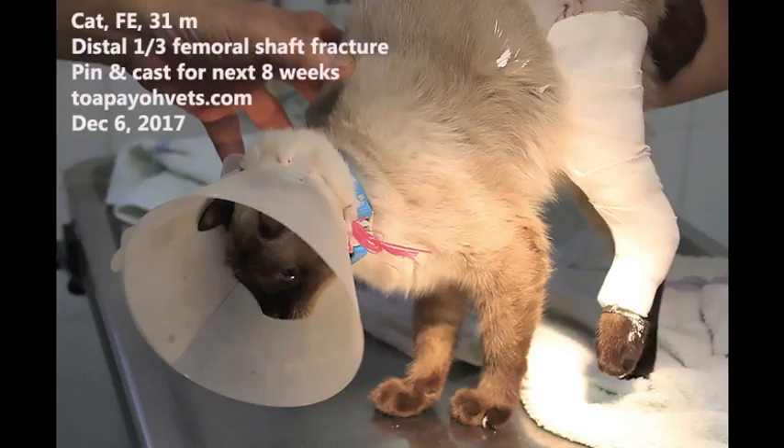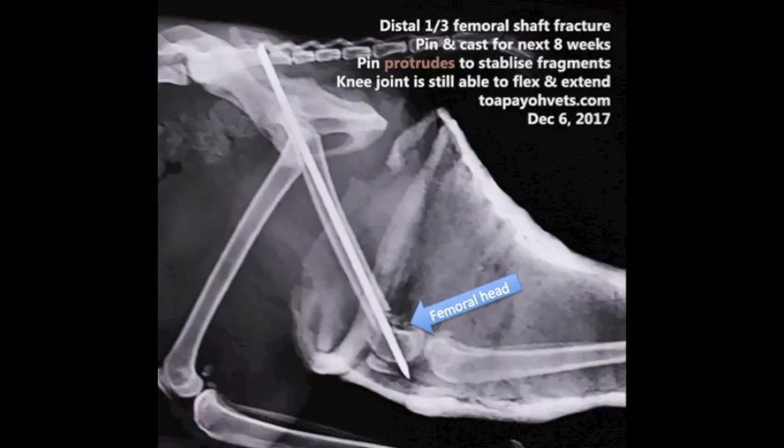Day 5, Surgery. Distal one-third femoral shaft fracture. A pin and plaster of Paris is placed and will be kept on for the next 8 weeks. The pin unites the fractured fragments and protrudes to stabilize the fragments. The knee joint is still able to flex and extend. The cast was placed as the fracture is too close to the femoral head, so pinning alone is insufficient to stabilize it.